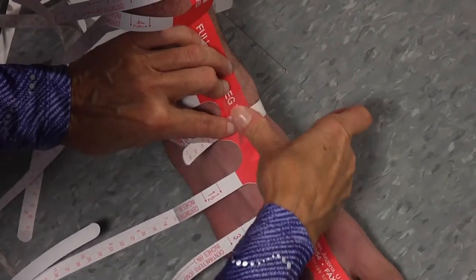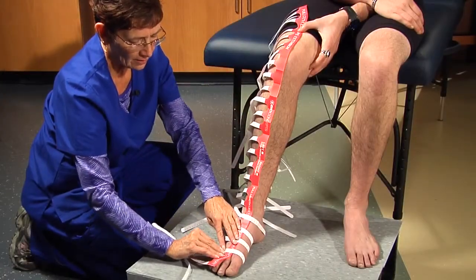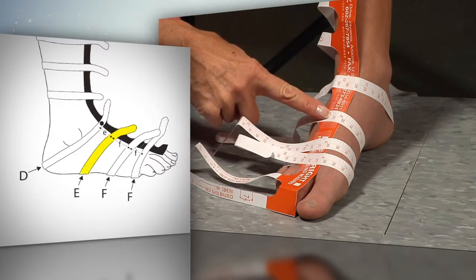Secure the straps around the foot. There could be from 1 to 5 foot tapes depending on the length of the foot. The paper tapes are 1.5 inches apart. The capital E circumference measurement is located 1.5 inches from the capital D measurement.